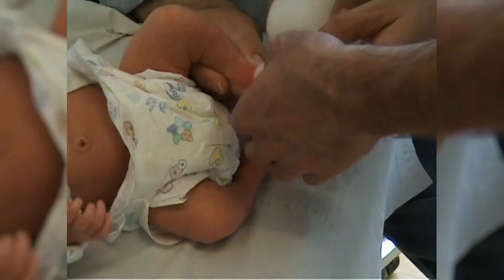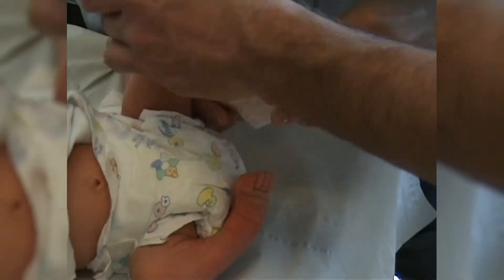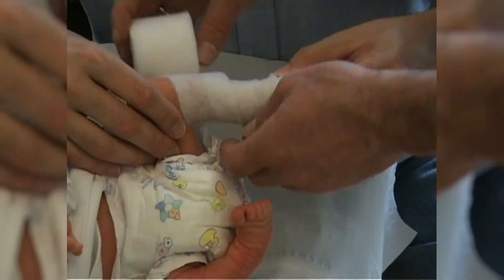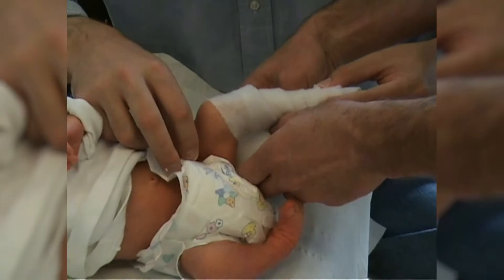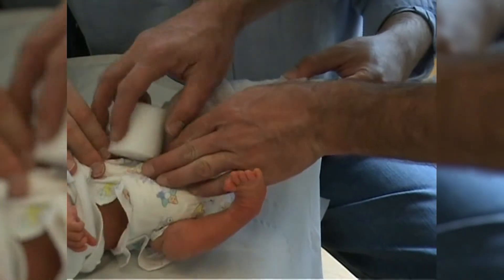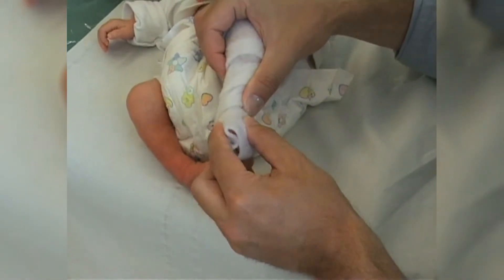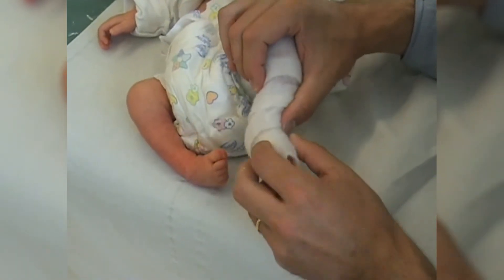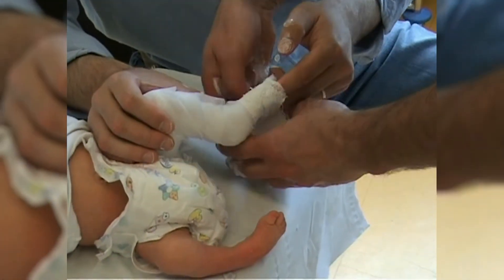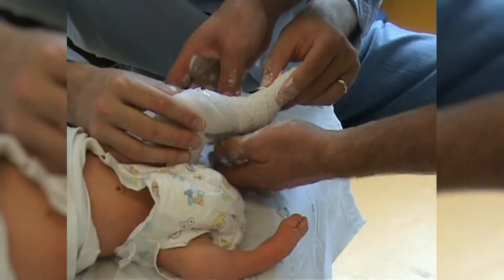When applying the plaster cast it is essential to apply the padding tightly around the foot to prevent the foot from sliding upwards later. The less padding material that is used, the better the manipulation will be in the cast. The direction of manipulation in the first cast is supination. The cavus can be corrected after only one or two casts.